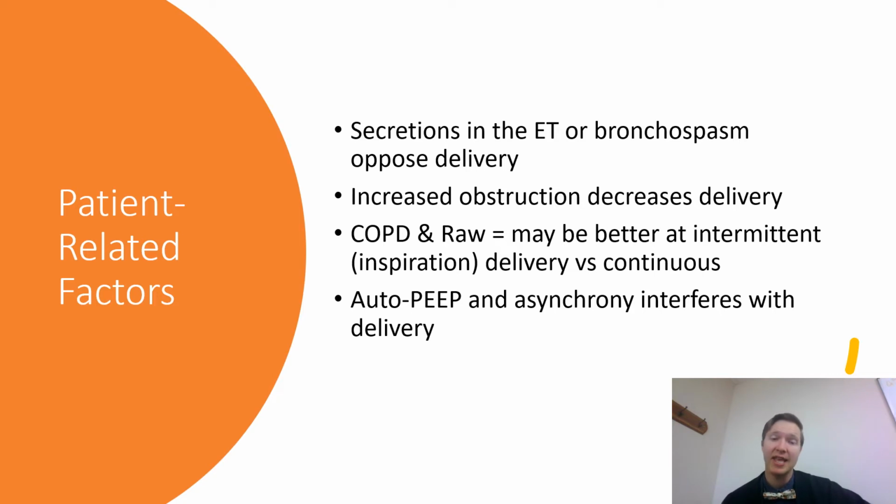Another factor to think about here is auto PEEP or intrinsic PEEP, sneaky PEEP, occult PEEP, any of those terms, right? And asynchrony can interfere with delivery, because what's happening? They've got to work past it. Can they exhale all that gas? No, there's a bunch of pressure built up, or they're working against the machine. It's going to interfere with that delivery.